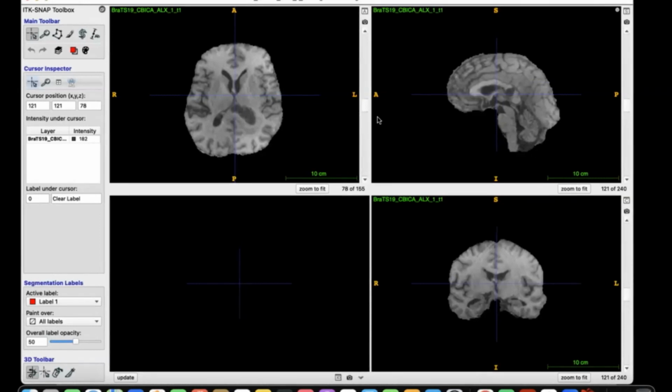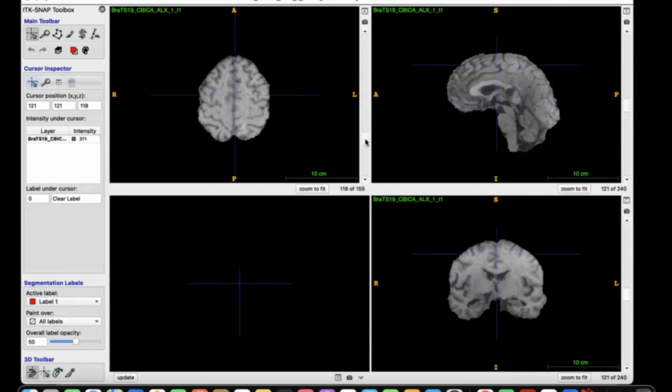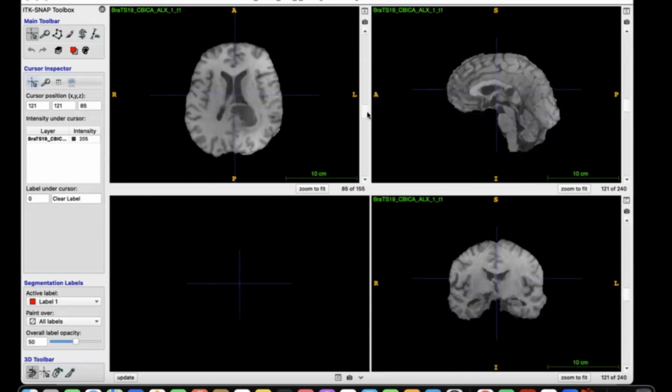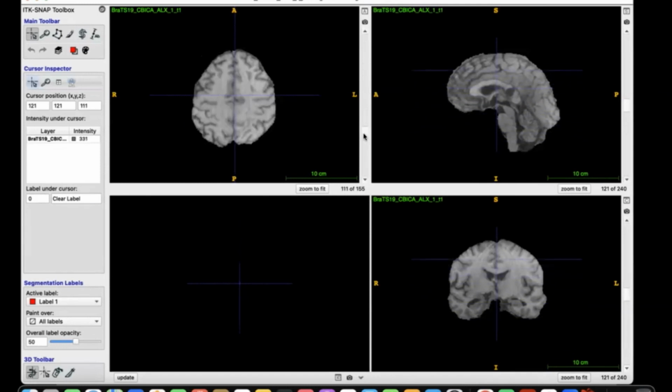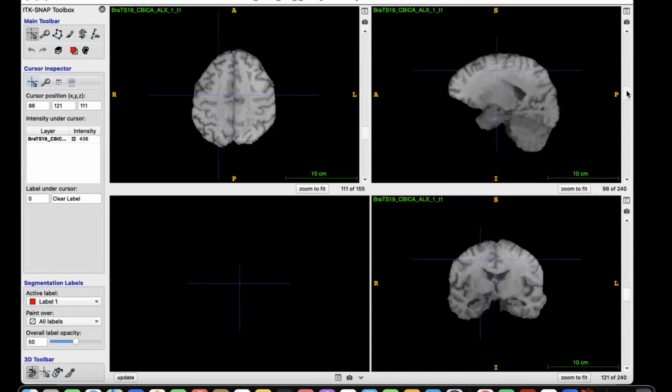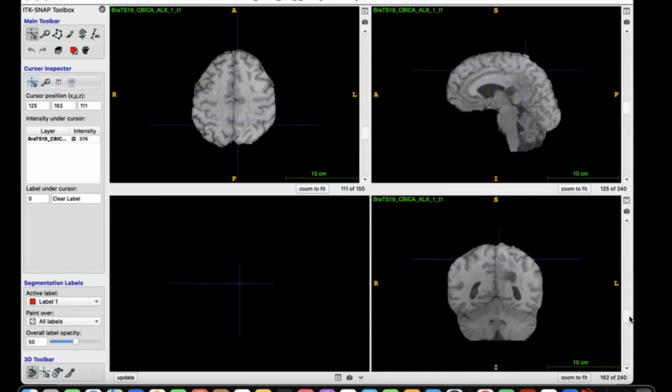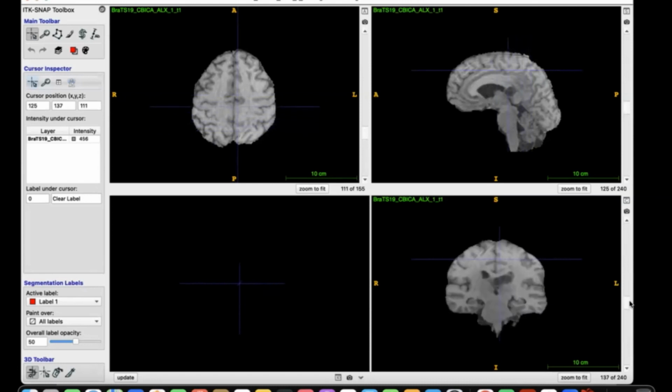So here, just like the CT image, you can check out different slices of these volumetric data, right? So this is the sagittal view, and you can also check, right? And this is the coronal view. So you can also look at this. Okay, so this is T1 weighted.